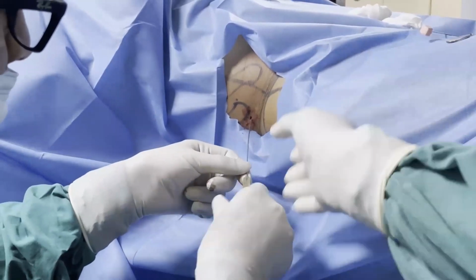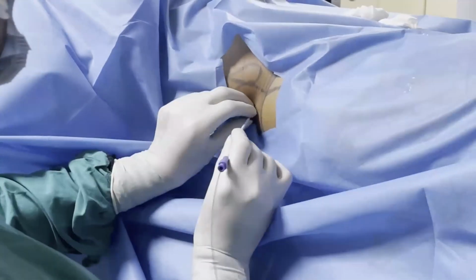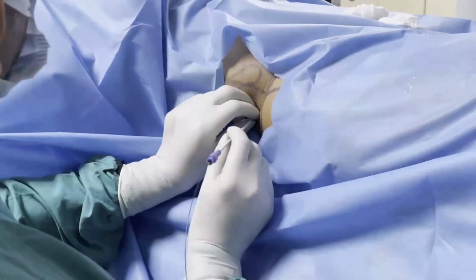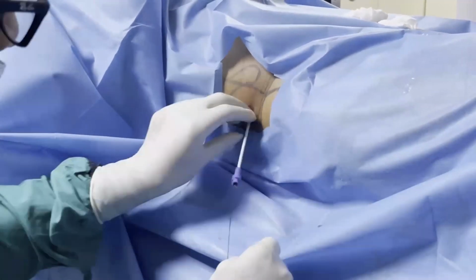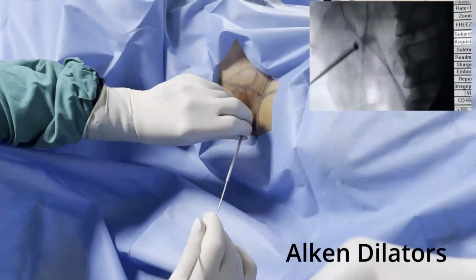Then we place the guide wire into the system. After parking the guide wire, we do tract dilatation with the help of Teflon dilators. Usually we do single dilatation, that is 10 French, and then after doing dilatation we place the guide wire straight forward. The guide wire and all these things are done under fluoroscopic guidance.